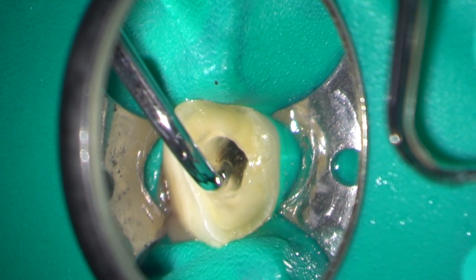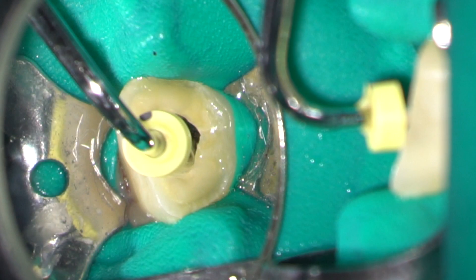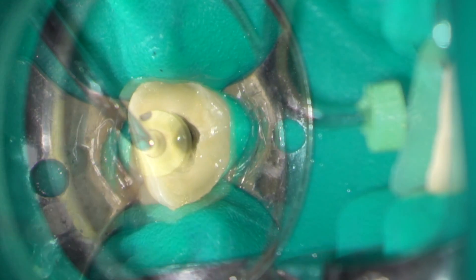Here you can see I'm pre-measuring my pluggers. A stop is placed on the plugger and the length confirmed.